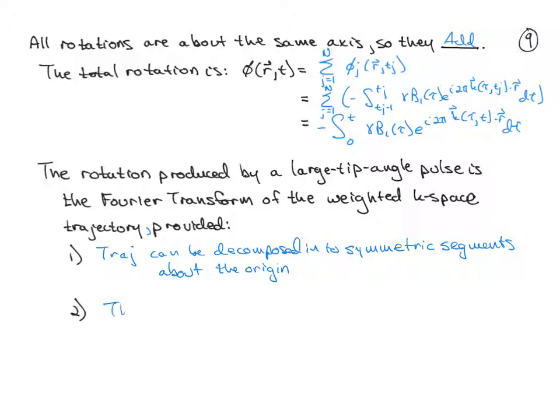And furthermore, that the RF pulse produces conjugate symmetric weighting when it's applied simultaneously with that trajectory.